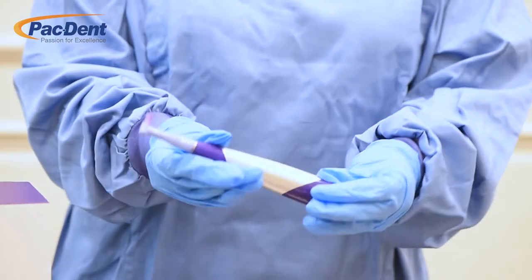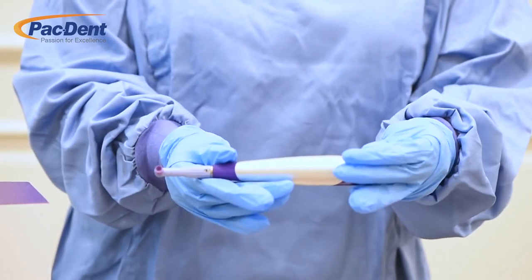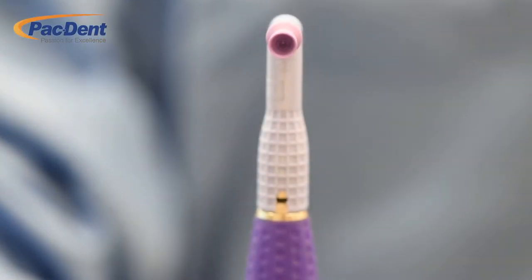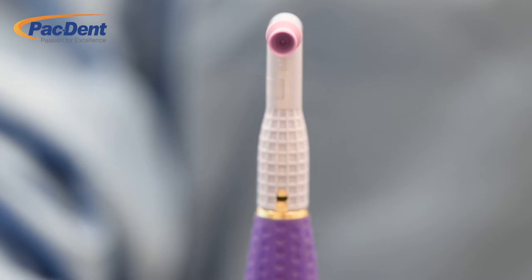Our well-balanced handpiece is one of the lightest in the industry and weighs 20% lighter than the leading competitor. The handpiece is also compatible with any Doriot-style disposable prophy angle.